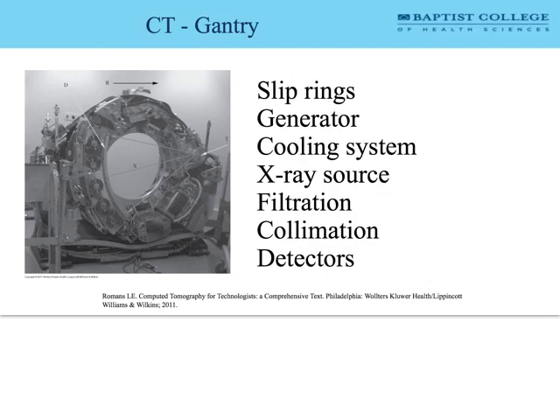So that technology was then put into a lot of different industries, and CT picked up on it pretty quickly with the development of the third generation scanners as a way to continuously power the gantry during data acquisition. Prior to the slip ring technology, we had to scan and then reset the scanner and then scan, and it was very laborious, and it created a bigger time gap for data acquisition and made for a number of problems. So we like slip rings.